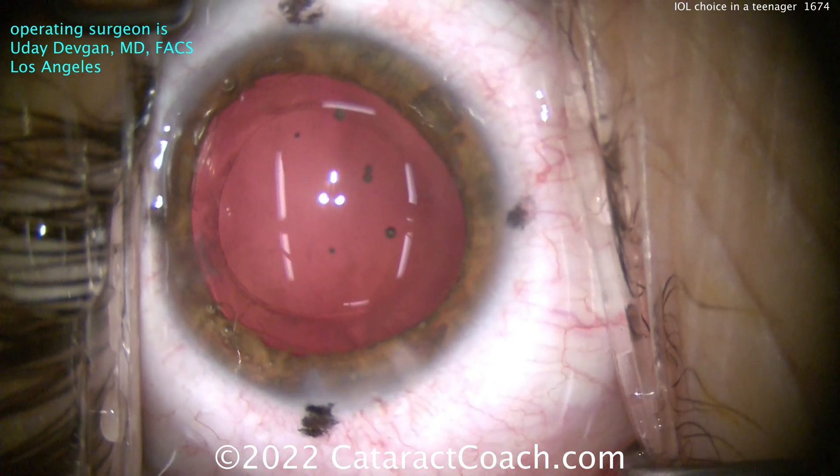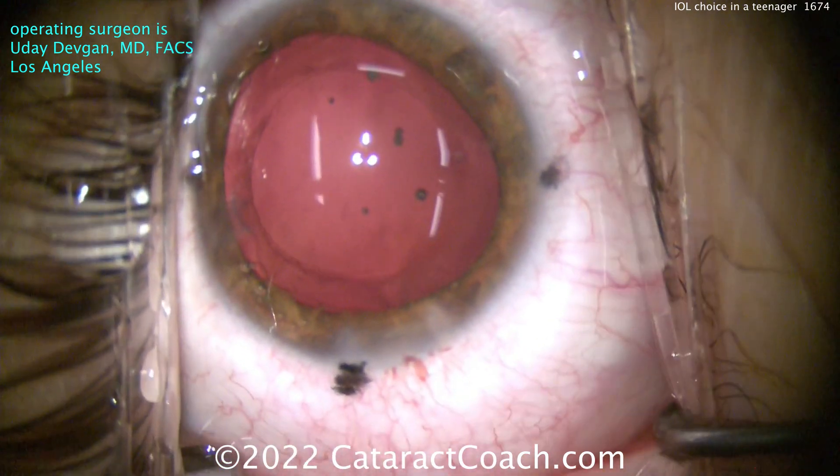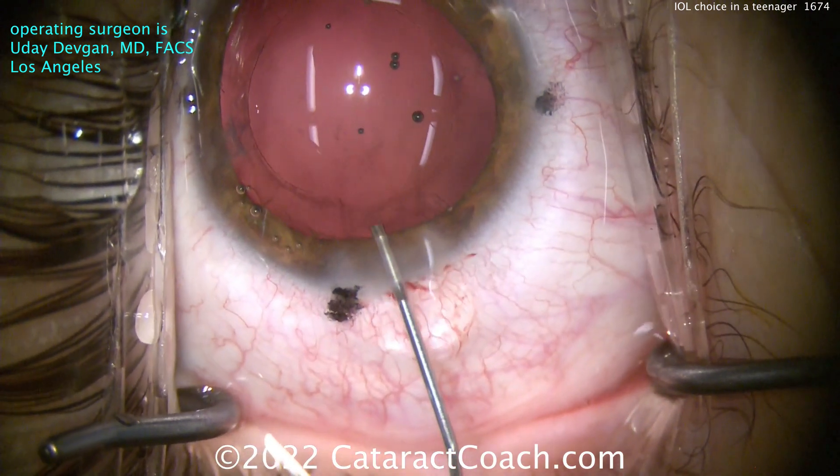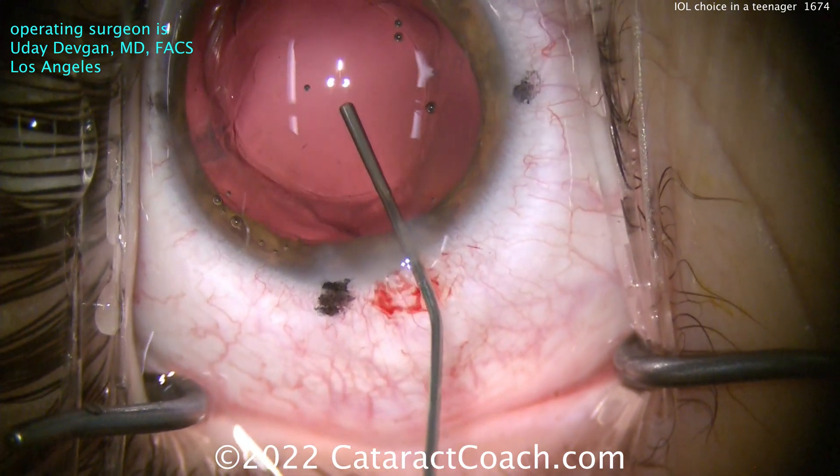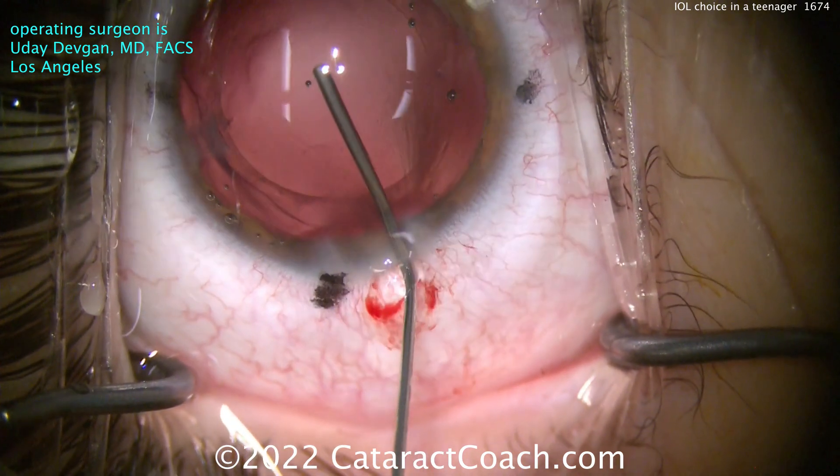I chose a trifocal toric lens with the new material — a PanOptix Clareon Toric. I chose this for a couple of reasons. Number one, it gives the patient a really wide range of vision. As a teenager, you don't want to be wearing reading glasses. You don't want to be emmetropic with great distance vision but then have to put on reading glasses to sit at your computer or look at your cell phone.